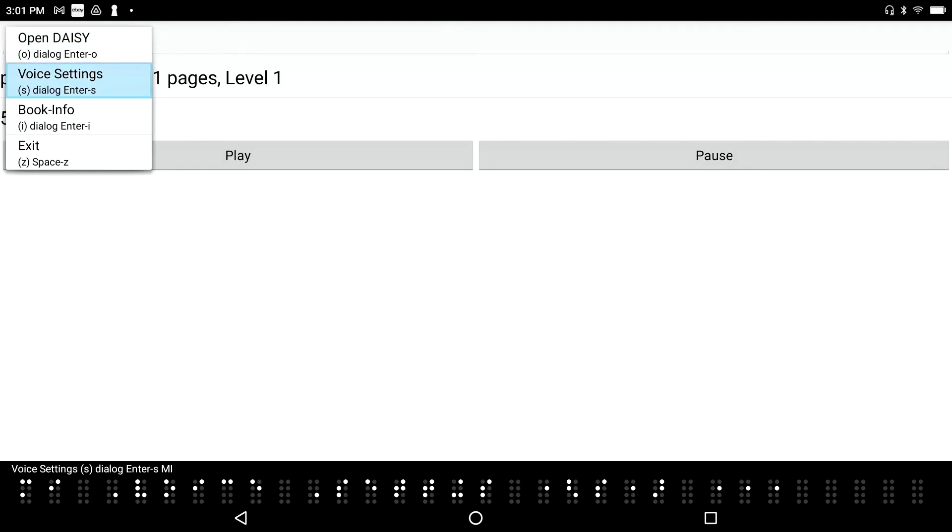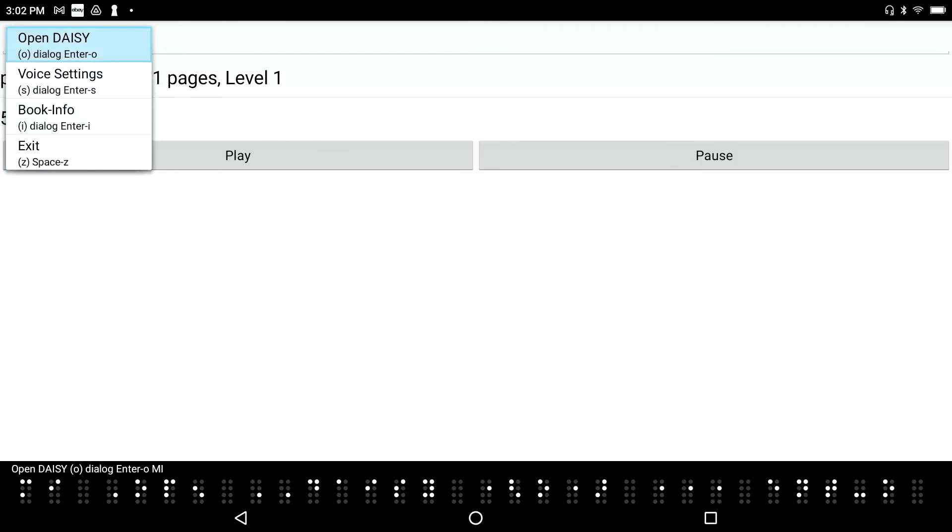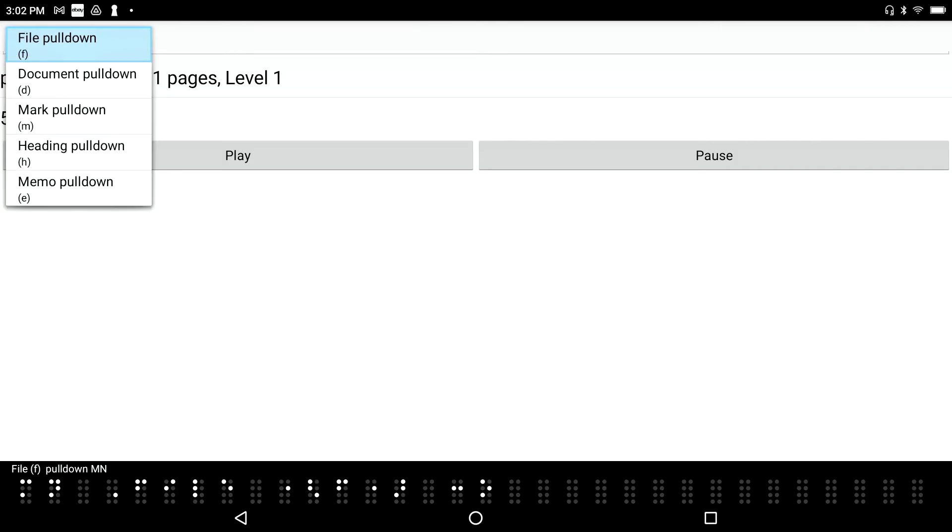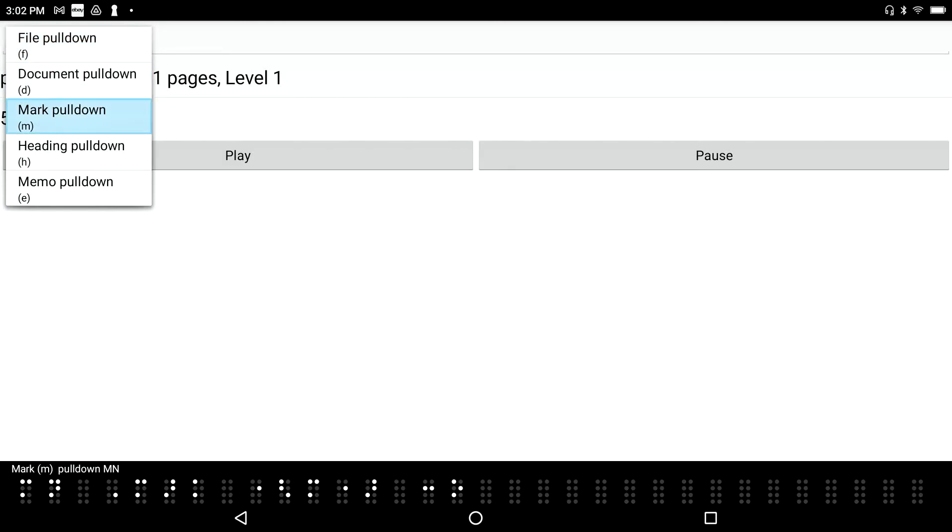Voice settings, dialog. Enter S. Book info. Dialogue. Exit, space. Open DAISY. Dialogue. Enter all menu item. Let's go ahead and I'm going to get out of that. Press F4. File. And let's see what else we have here. Document, pull down menu. Mark, pull down menu. So I can actually bookmark where I am. I'll go into this menu. Set mark, dialogue. Enter a menu item.